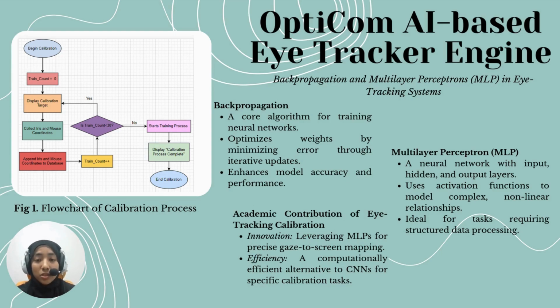The academic contribution includes innovation by leveraging MLP, which is multi-layer perceptron, for precise gaze-to-screen mapping. And it is more computationally efficient than other algorithms like CNN for calibration.